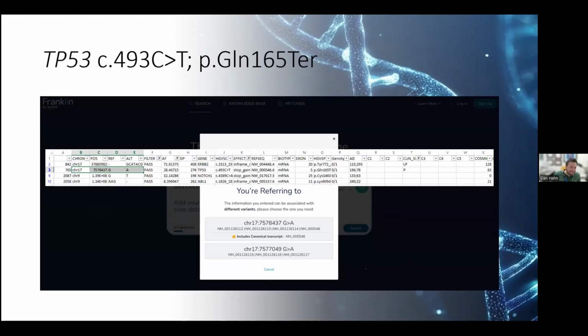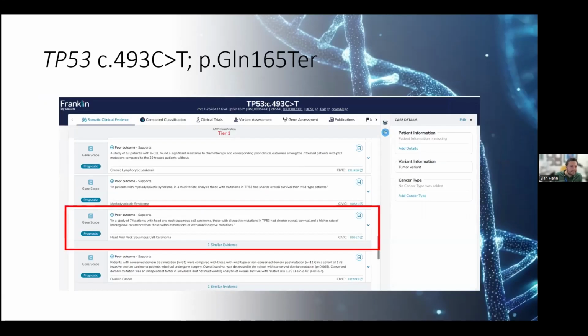So looking back, we're talking about the top one. So if you see the chromosome and position, it's the top one, which is why we say to use genomic coordinates where you can, because it allows for transferability between resources. And then also, if you take a look at our RefSeq ID, that's also listed as the canonical transcript ID in the top option.